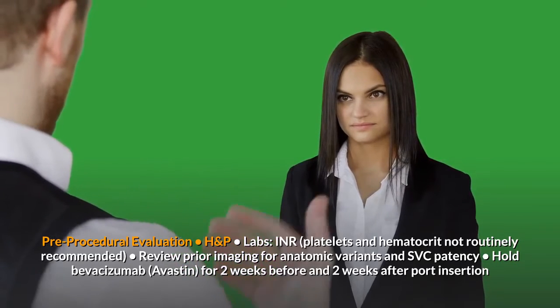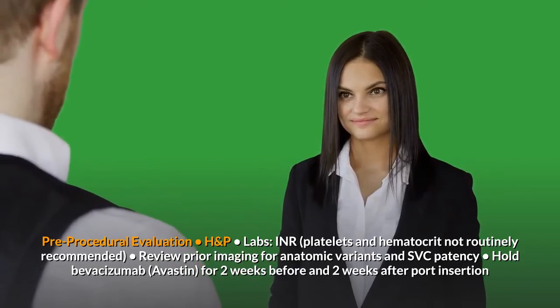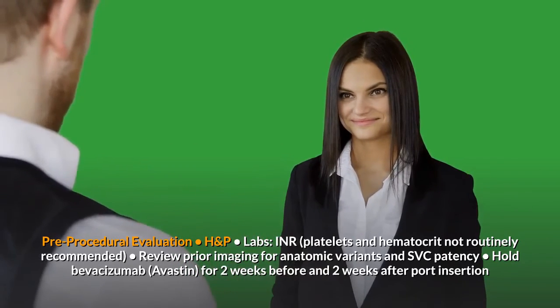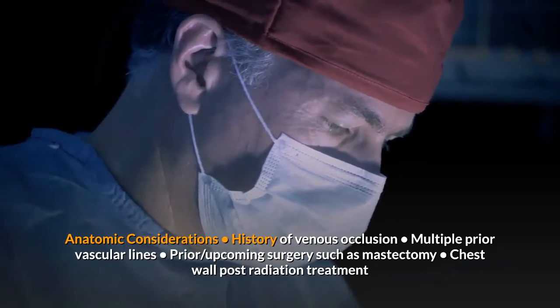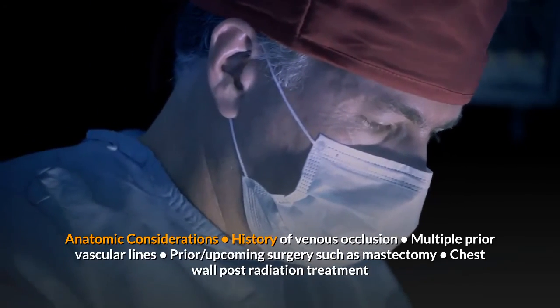Review prior imaging for anatomic variants and SVC patency. Hold bevacizumab, Avastin, for 2 weeks before and 2 weeks after port insertion. Anatomic considerations: history of venous occlusion, multiple prior vascular lines, prior or upcoming surgery such as mastectomy, chest wall post-radiation treatment.